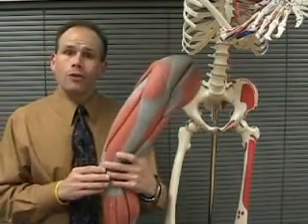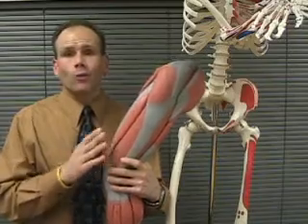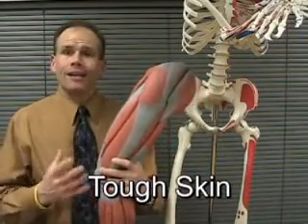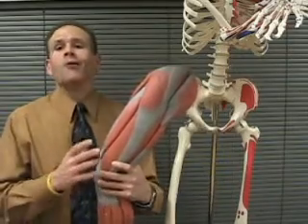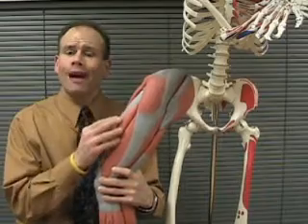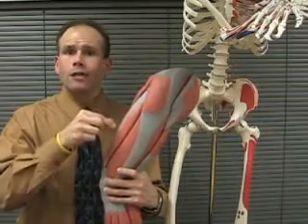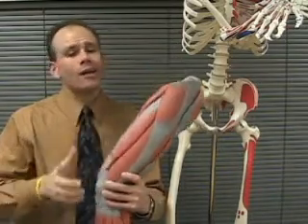Unfortunately, on the thigh measurement, many people have a condition that we just tend to call tough skin. Tough skin is a condition, we'll call it, where people have a little bit more connective tissue holding the superficial fat down to the muscle. We have a difficult time pulling that subcutaneous fat and skin away from the muscle and getting a good measurement.